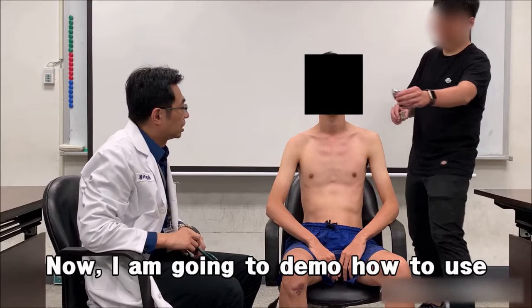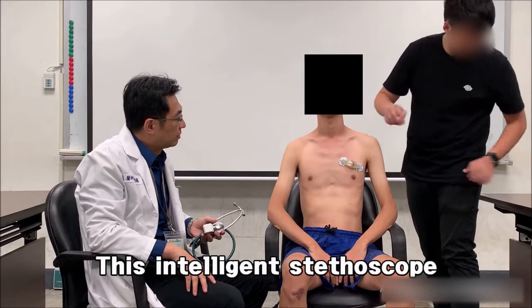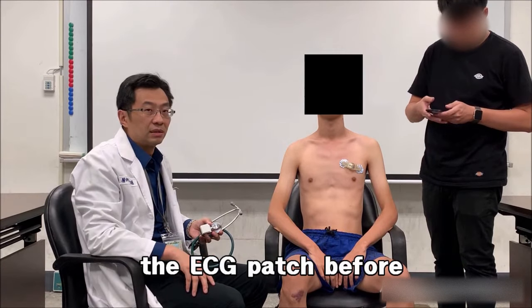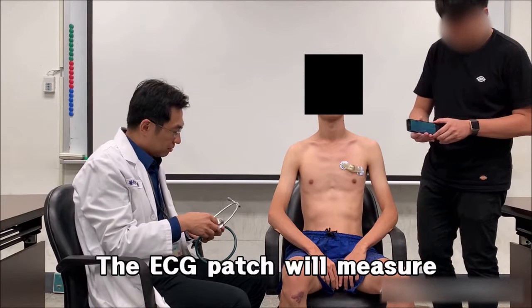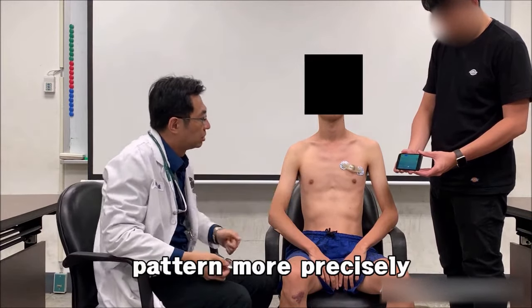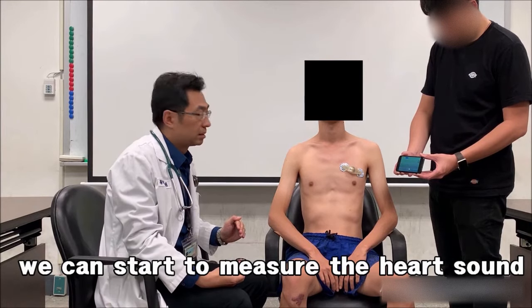Now, I am going to demo how to use the proposed intelligent stethoscope. This intelligent stethoscope can bind the ECG measurement. So, it is necessary to attach the ECG patch before we start auscultation. The ECG patch will measure the human's ECG signal, which will help to define heart sound patterns more precisely. When the ECG signal becomes steady, we can start to measure the heart sound.